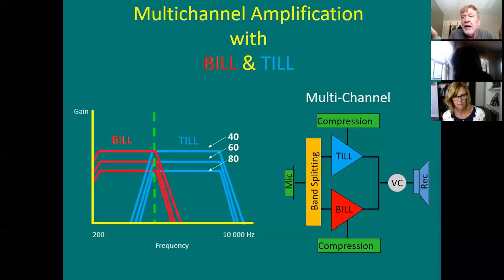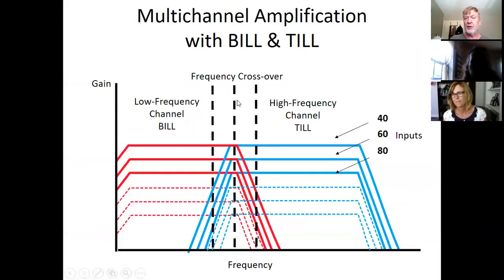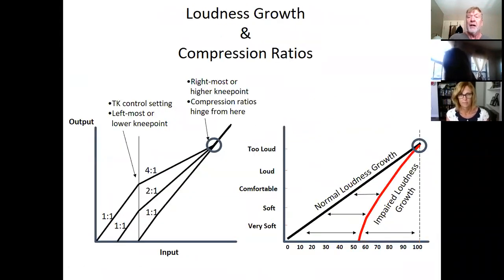You know, the hearing aids were very flexible then. We thought, ooh, are we ever cool? Here's a picture of that. They called that the frequency crossover, where the 2 channels meet. Okay? And the low frequency channel Bill, high frequency channel Till, you know what I mean.